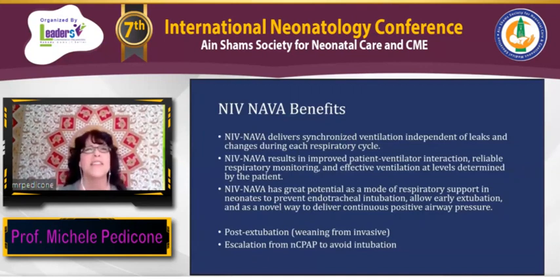Benefits. All right. So NIV-NAVA delivers synchronized ventilation independent of leaks and changes during each respiratory cycle. So again, the ventilator doesn't have to look at trends and determine what to deliver to the patient. NAVA results in improved patient-ventilator interaction and effective ventilation at levels determined by the patient.